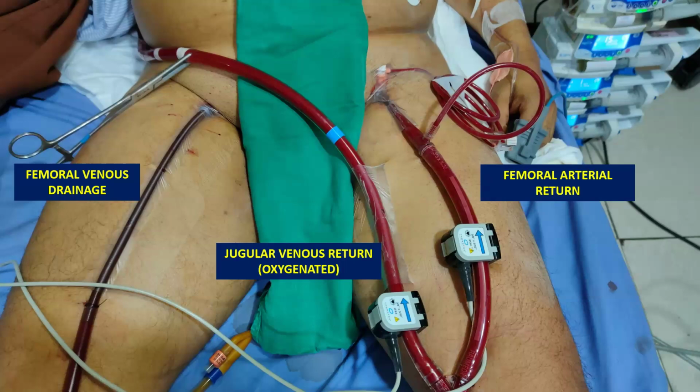Always remember, don't keep it always clamped, and at times you have to just release the clamp for a few seconds. Otherwise, there can be stasis of blood there and clot formation.